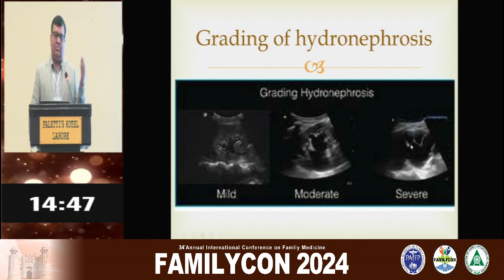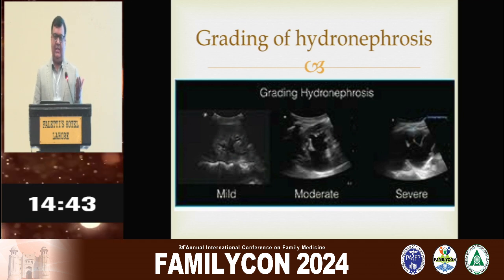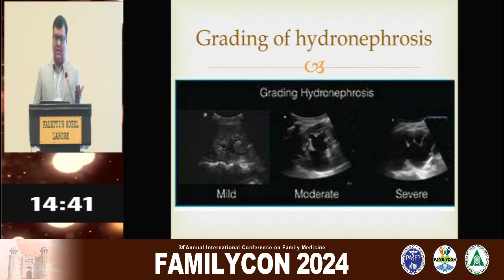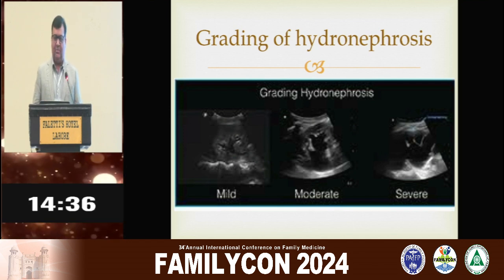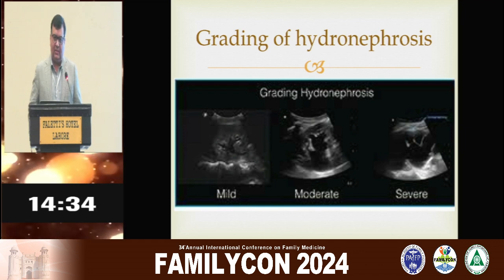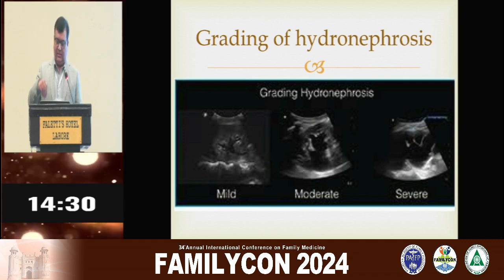When you are scanning, if you scan laterally, you can scan the top of the ureter because the rays are coming through the kidney, so you can easily see the stones at the upper ureter. Similarly, if the bladder is full, you can see the stones at the vesico-ureteric junction when you're looking back.